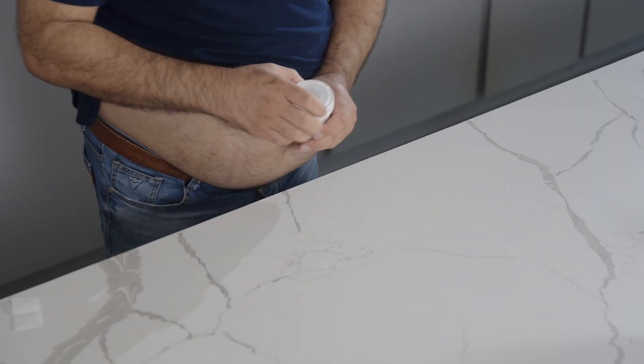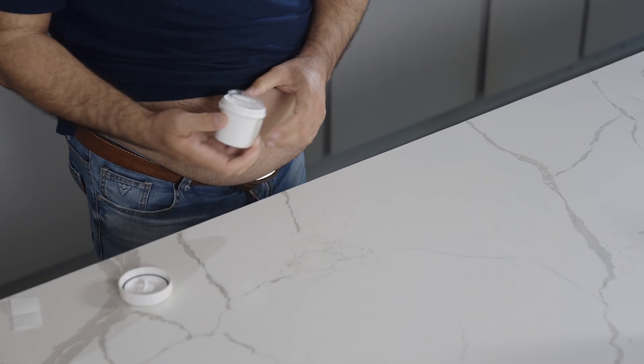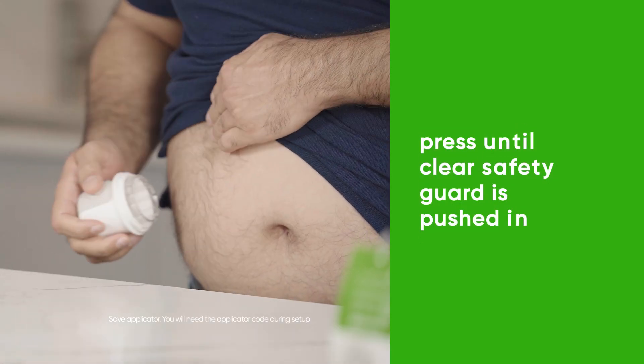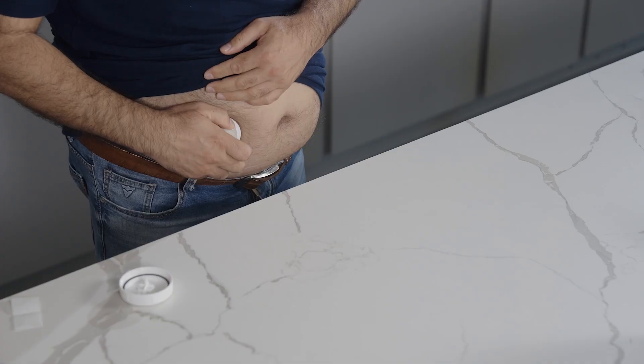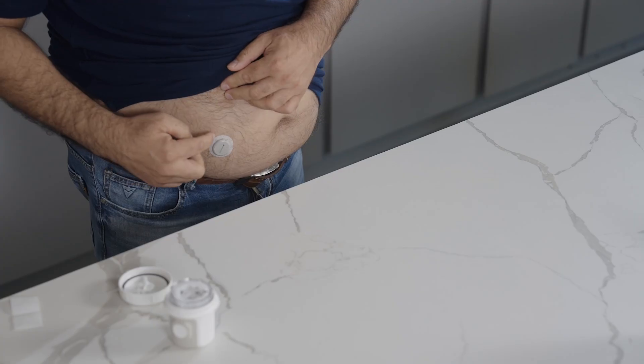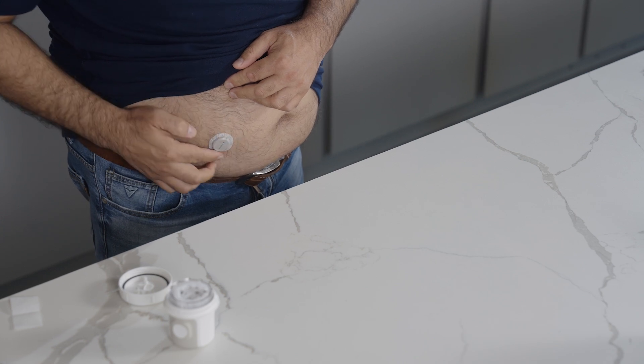Grab your applicator and unscrew the cap. Don't touch inside the applicator. Press and hold the applicator firmly against your skin until the clear safety guard is pushed in. Now push the button and then remove the applicator.